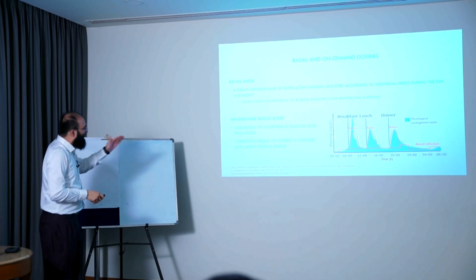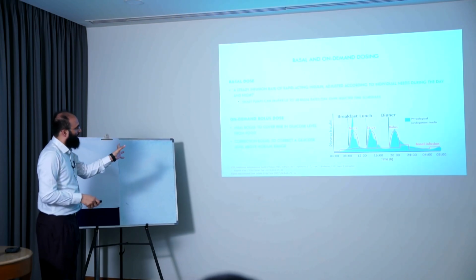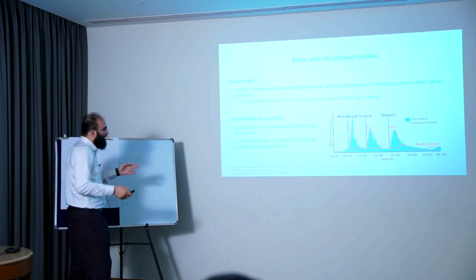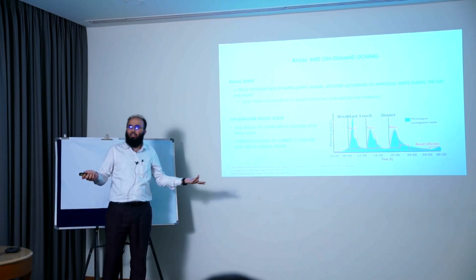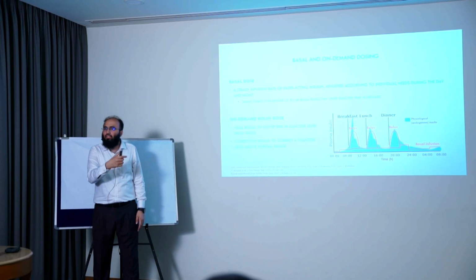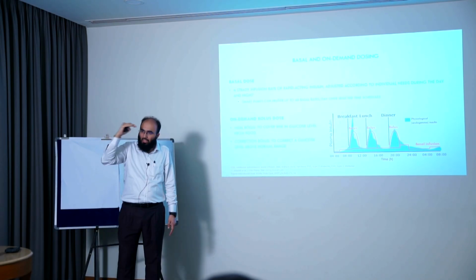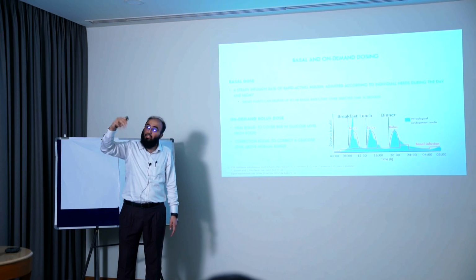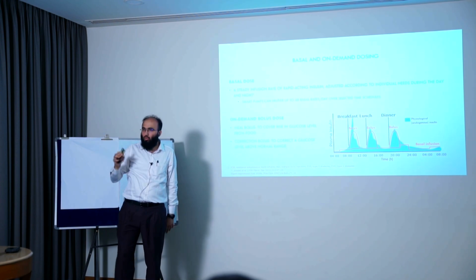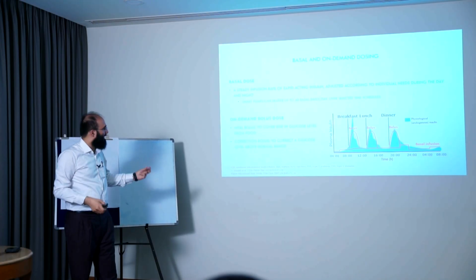On-demand bolus dose: meal bolus to cover rise in glucose level from food, correction bolus to correct the glucose level above the normal range. You thought this patient will have 100 grams of carbohydrate, but he had 125 grams. And that 2.5 units was not delivered, due to which his sugar is going up. 180 is your cutoff for in range. It is going beyond 180, it touched say 250 also, 240 also. Then for that degree of hyperglycemia, it starts giving correction boluses.